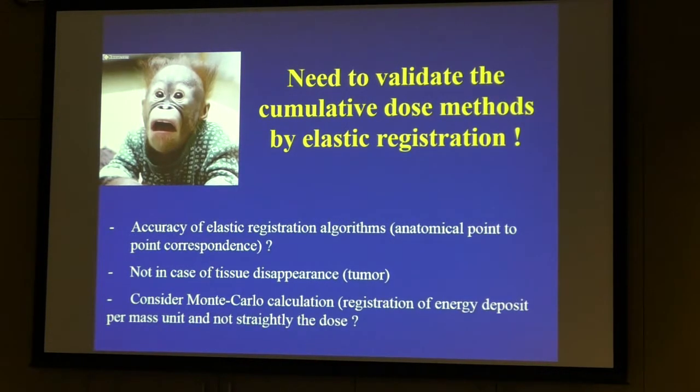The first one is really to consider the accuracy of your elastic registration algorithm. Depending on the algorithm, the accuracy may be different. You cannot use elastic registration to accumulate the dose in case of tissue disappearance.